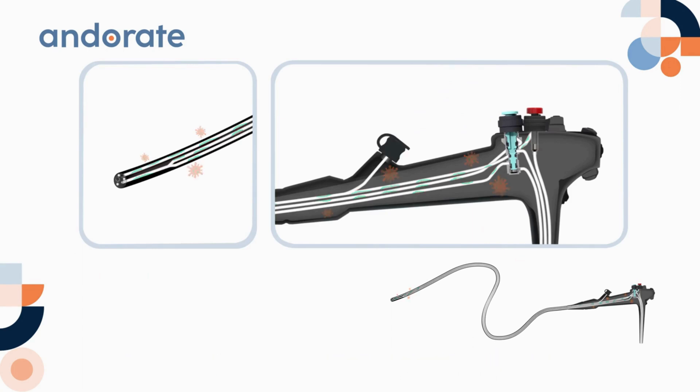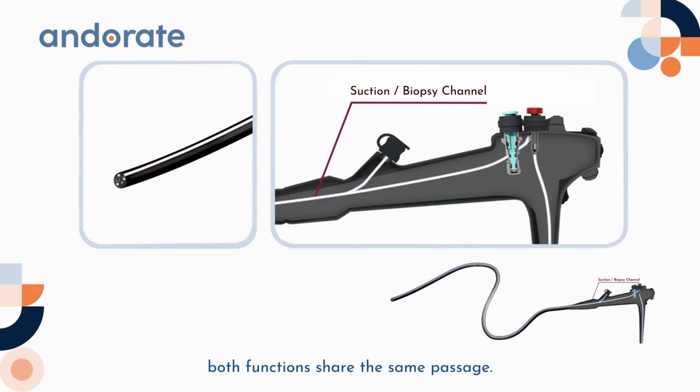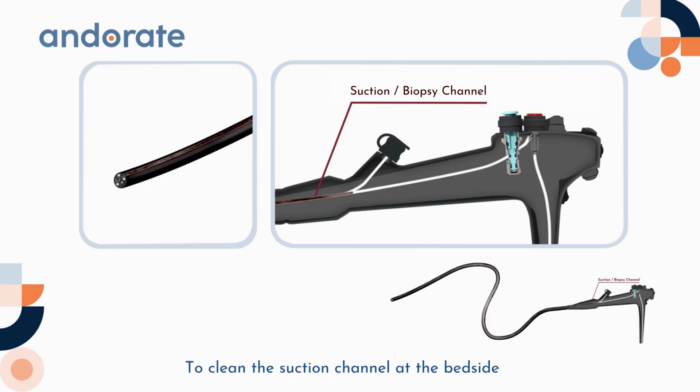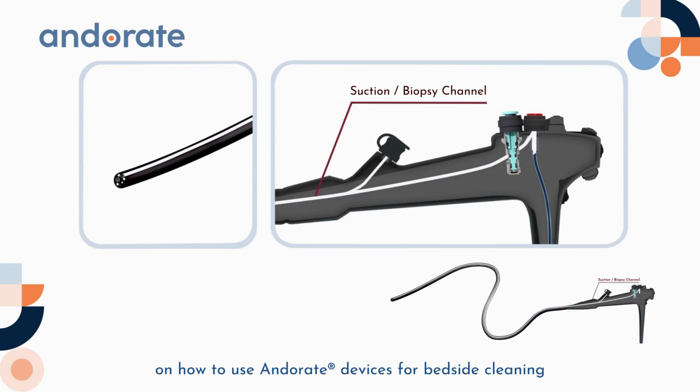Now let's check out the suction channel. The suction channel is also the biopsy channel — both functions share the same passage. This suction channel is used for suctioning and removing fluids, debris, and other contaminants during procedures. To clean the suction channel at the bedside, use the procedure suction valve to draw detergent into the channel for flushing for 30 seconds, then suction air for 10 seconds.